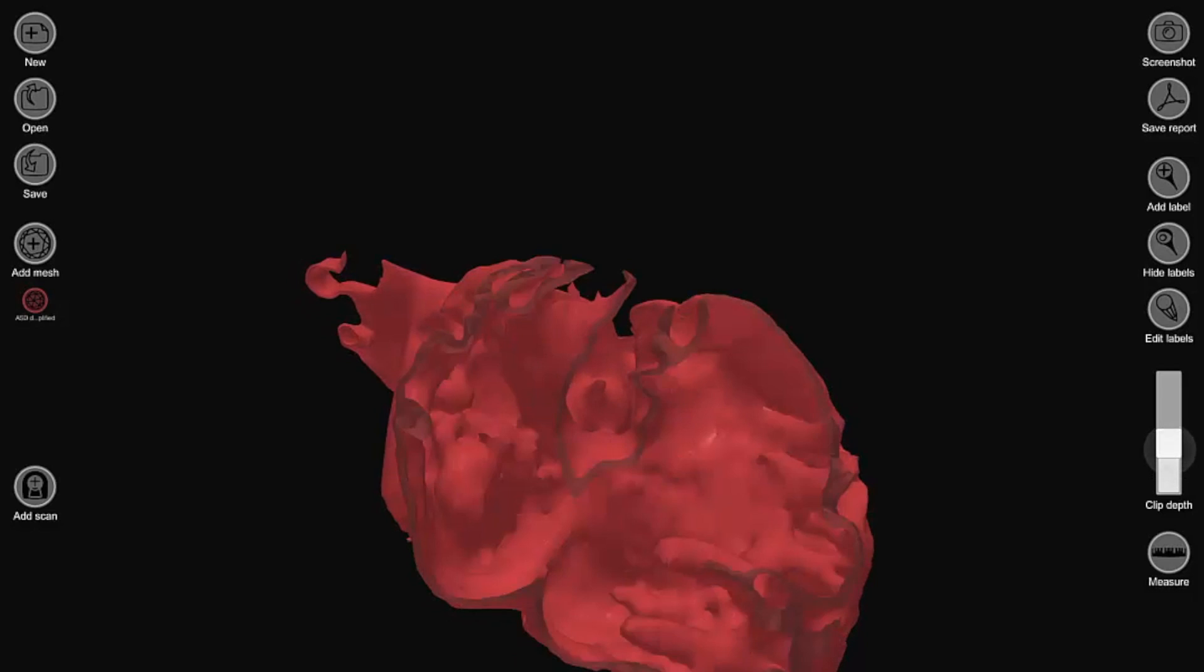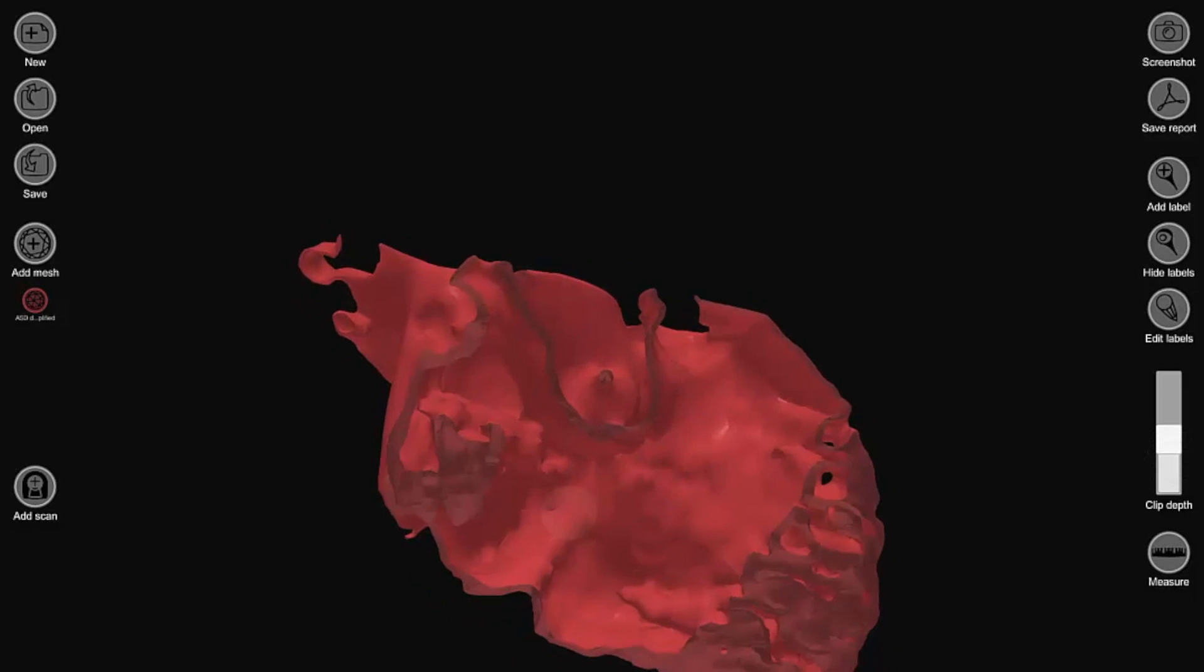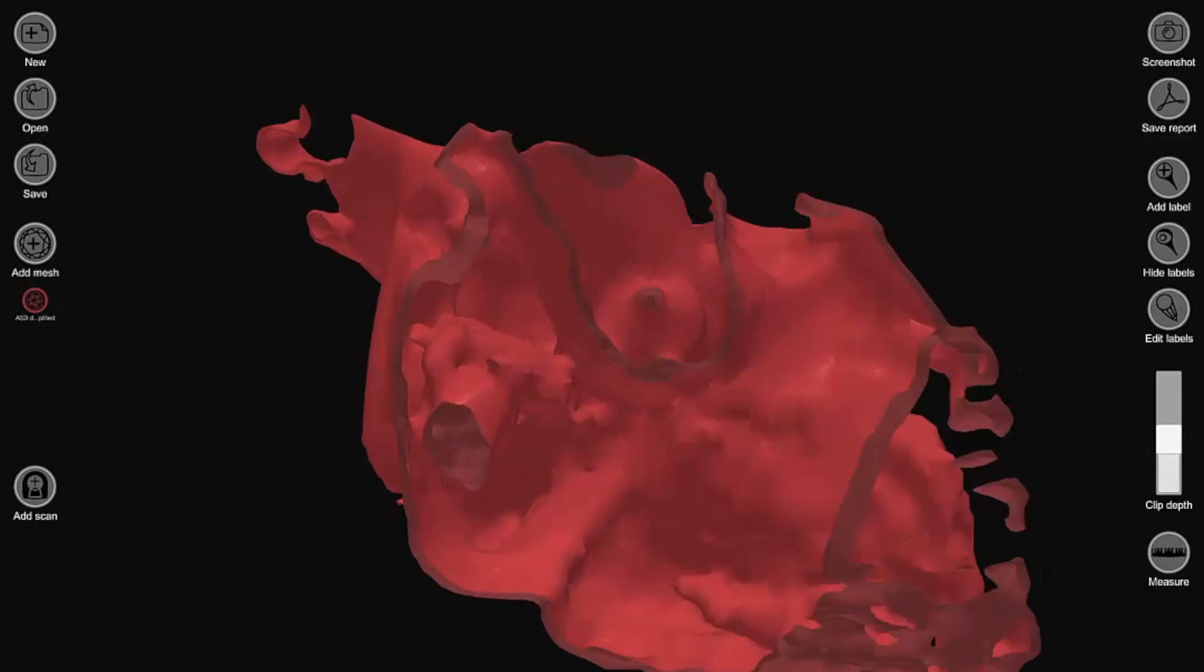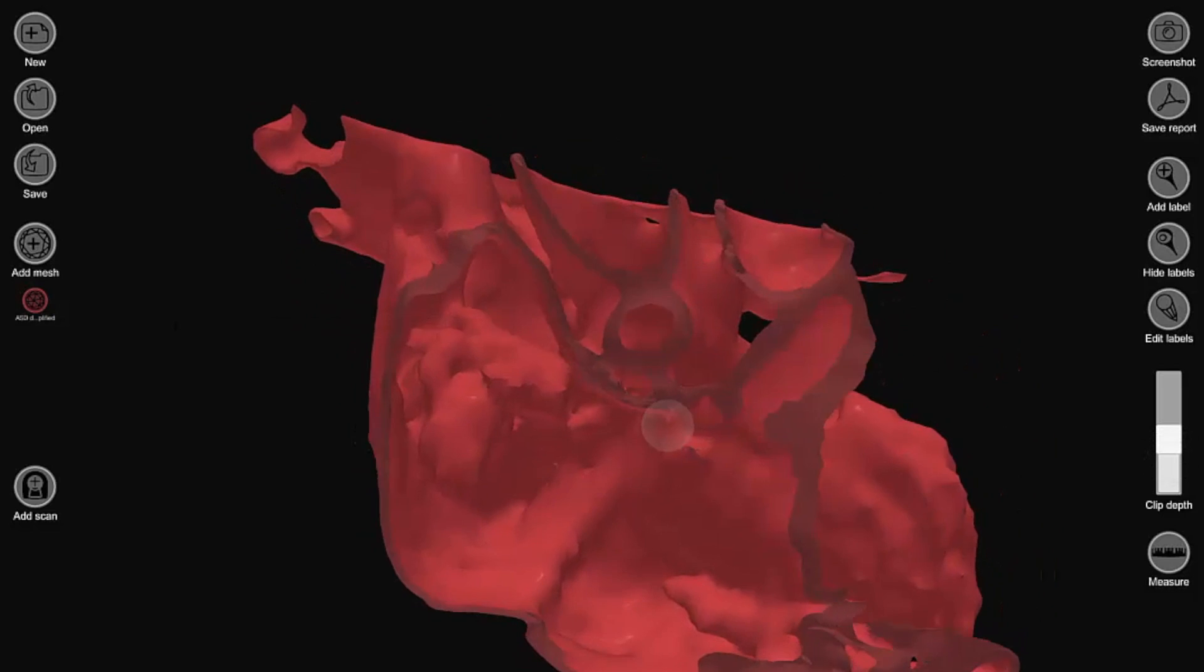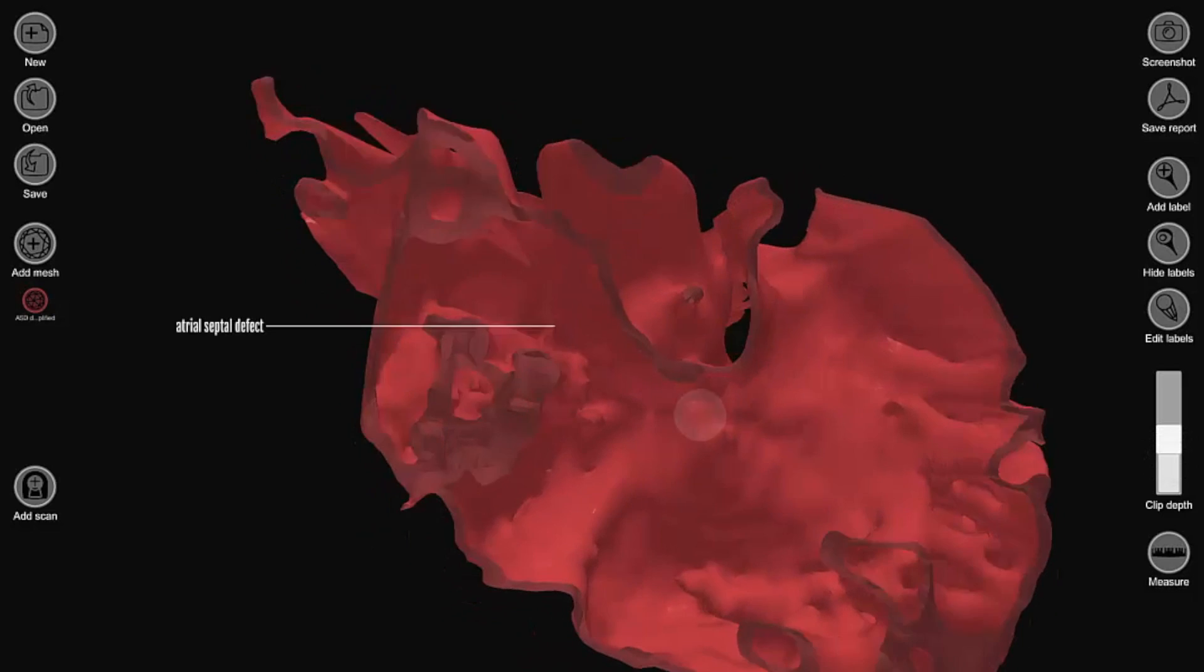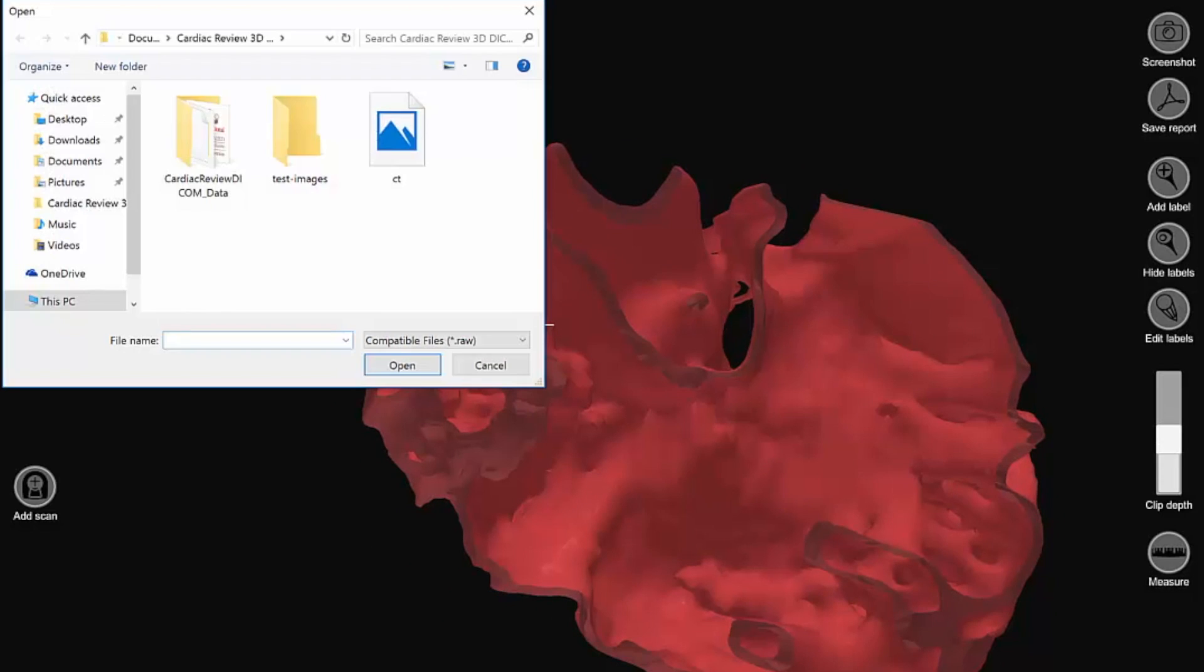The model can also be enhanced by displaying it on a background of the medical images from which it was derived.